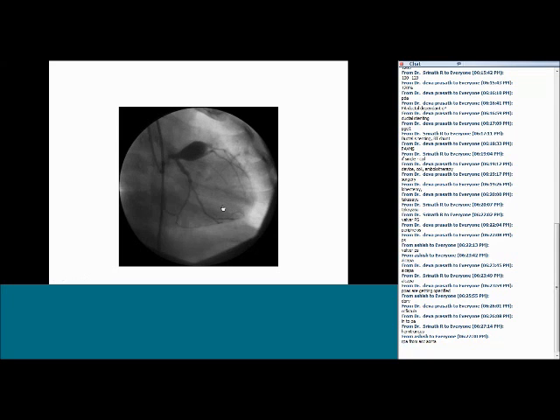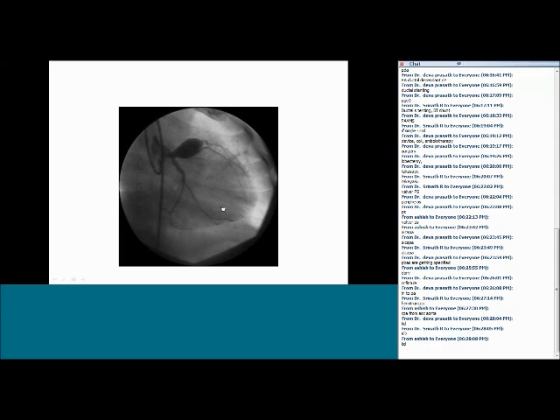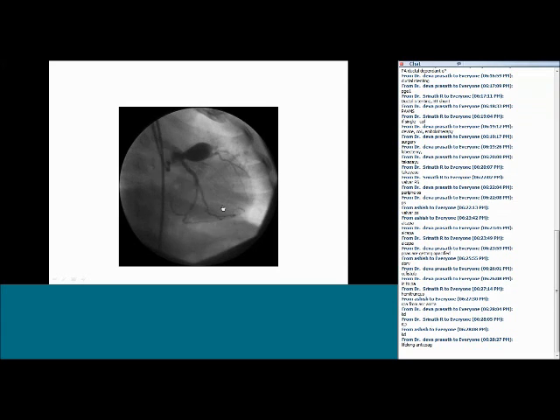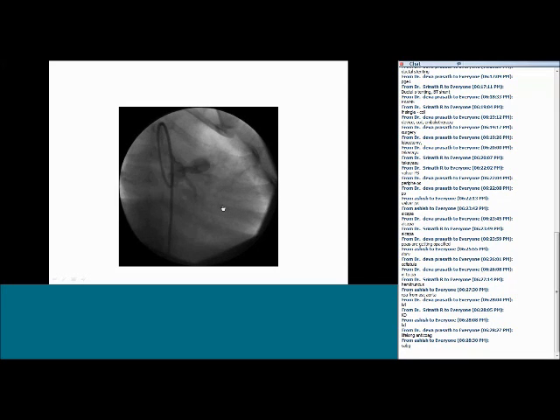Okay, diagnosis. Yes. Now, what would be your management guidelines for this particular patient? In very short, you can just write what the management guidelines are. This Kawasaki's disease everyone has written, but the correct diagnosis should be giant aneurysm in Kawasaki's disease. Okay, someone writes lifelong anticoagulation, and someone writes CABG.